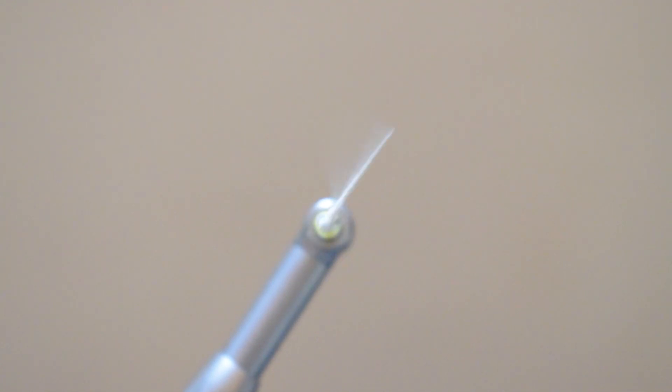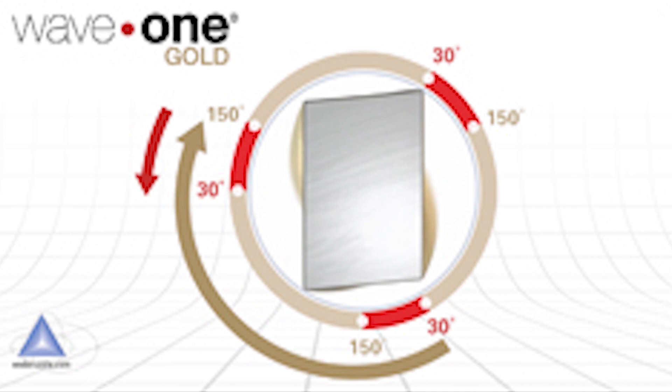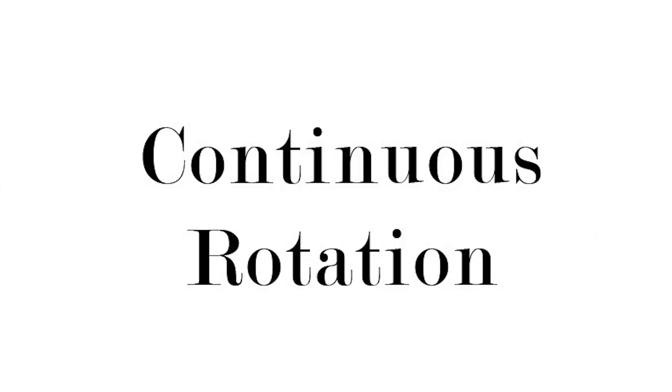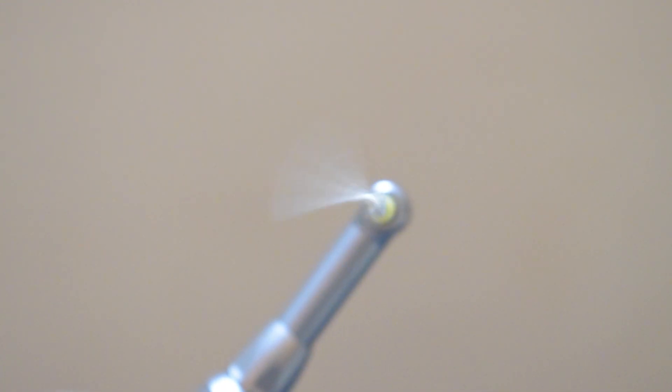As you can see in the first video, the file doesn't rotate a complete 360 degrees in one motion — it does multiple clockwise and anti-clockwise rotations depending on the mode selected. Many files like Wave One are meant to be run in reciprocation mode, and in those situations this motion is really helpful. In the continuous rotation video, as you can see, the file continuously rotates a full 360 degrees with no anti-clockwise rotation.